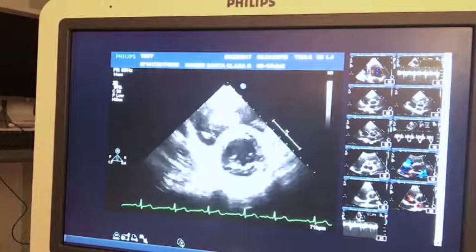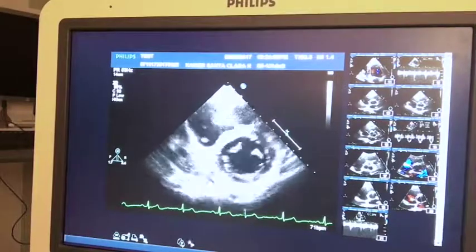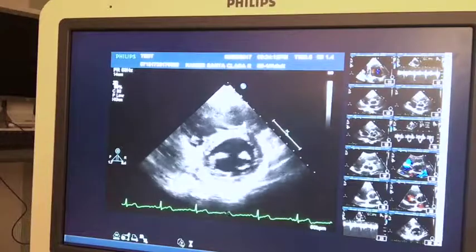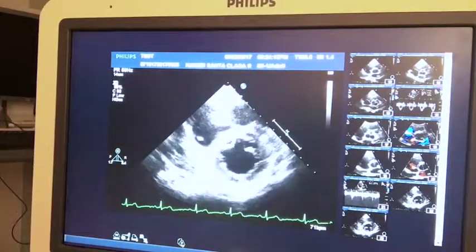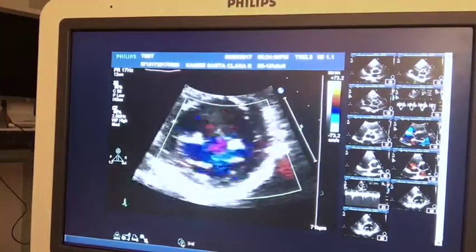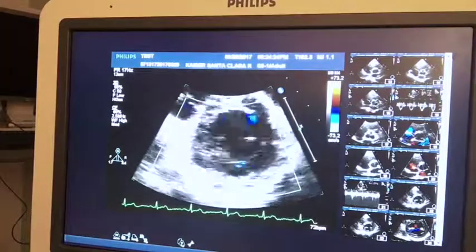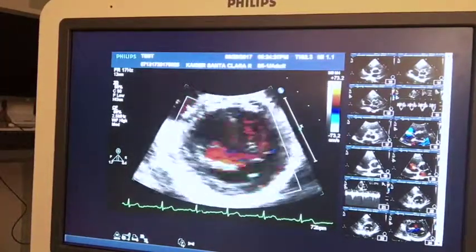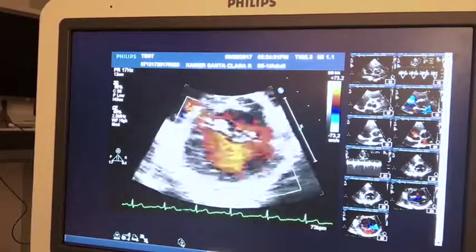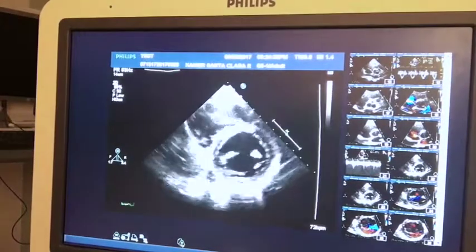Now I'm going to shift a little bit more south on the heart and see the mitral valve in short axis. You can see the papillary muscles, and now that I have the valve, I'm going to put color on it. I'm going to zoom into it a little bit. I'm going to capture that, I'm going to see if there's anything that's interesting. The hardly-there, tiniest little wisp of MR we saw earlier, we can see on the posterior leaflet. It looks like the tiniest little jet.